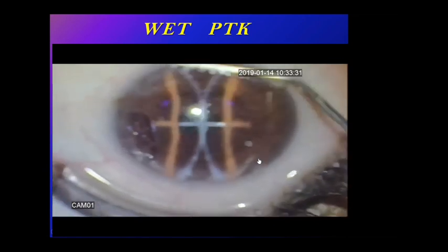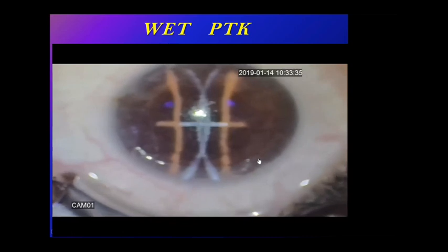And we don't shoot the cornea. We shoot on the BSS itself. Shooting on the BSS, I used to call this tsunami, because every shot of laser induces a lot of plasma, which is bubbles. These bubbles expand and collapse in parts of a thousandth of a second. This expansion and collapse in the fluid makes a mechanical wave that removes all this fine irregularity. That's why I called it tsunami, because a tsunami removes all the houses, cleaning out the area.